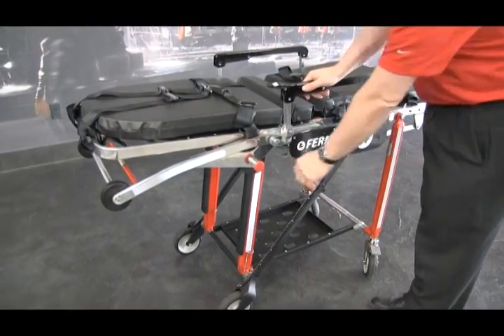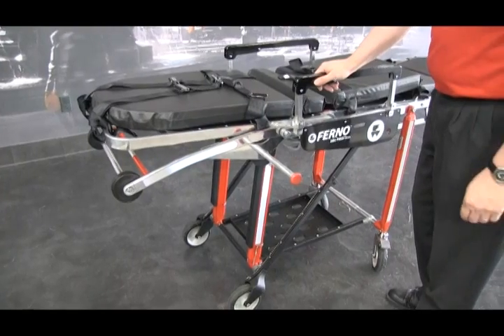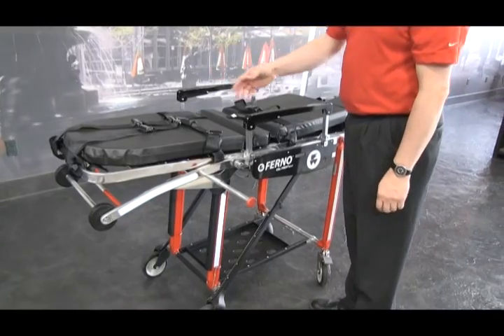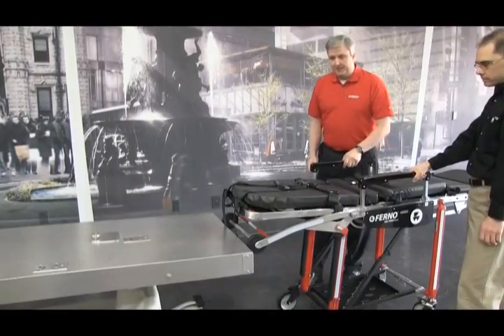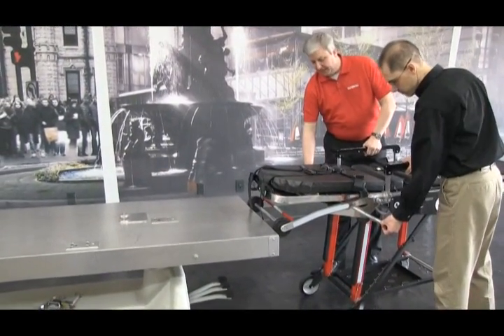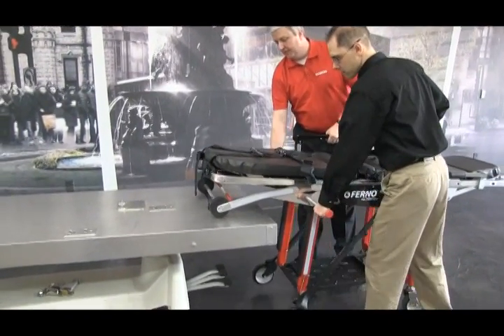One feature of the 28Z is the pull-out telescoping handle — there's one on each side of the cot. This is useful to help get the cot into higher load height vehicles. You can have one operator on each side grab the cot and help get it up to a higher load height. To use the telescoping handle, pull it out, lift up the cot, and load it.